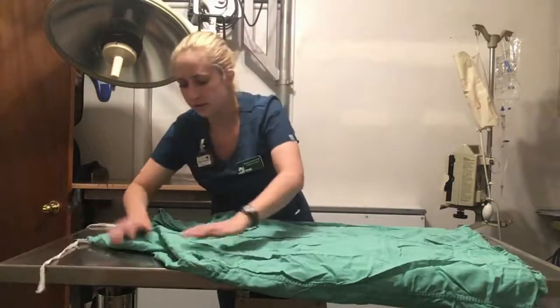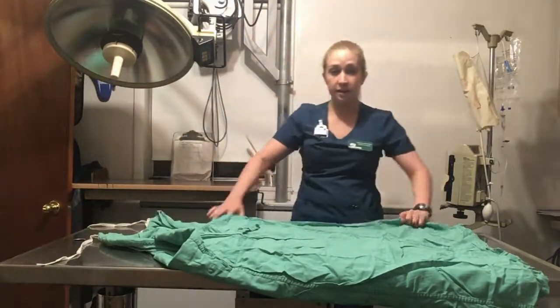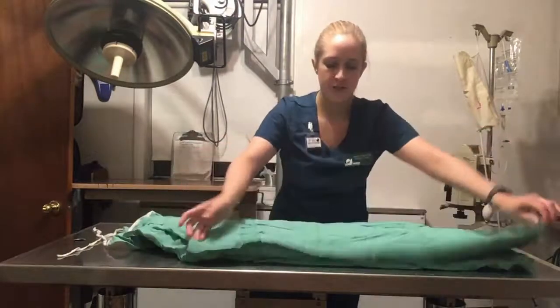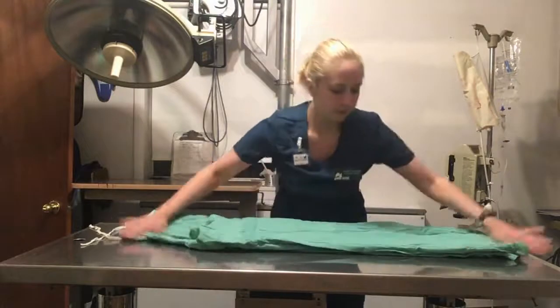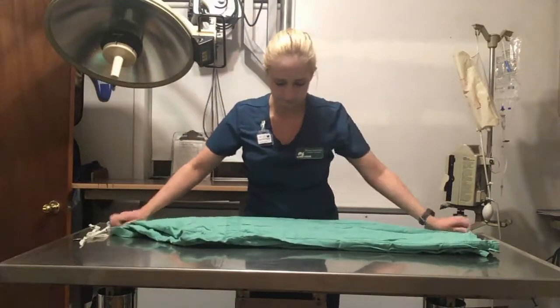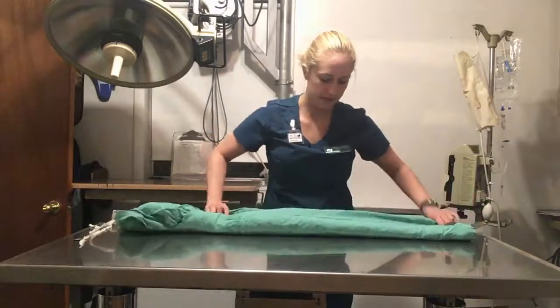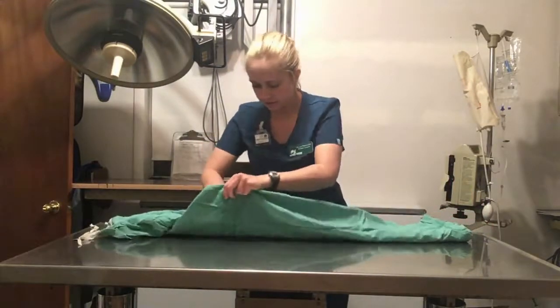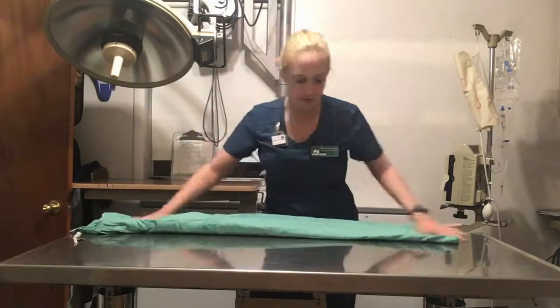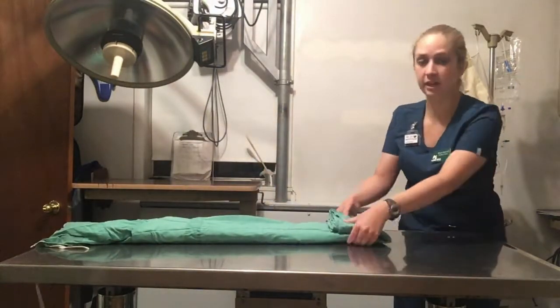So then the next part is you're going to take the entirety of the side, both sides. You're just going to fold them into each other, folding them in half. So now you have more of a streamlined gown. Once you've done that, you're going to fold that in again. Try and keep it as even as possible and flat and straight as possible. And so then you're going to accordion fold it like you would any other pack.